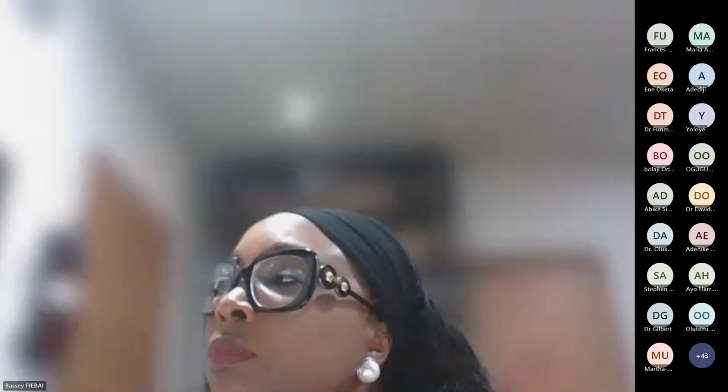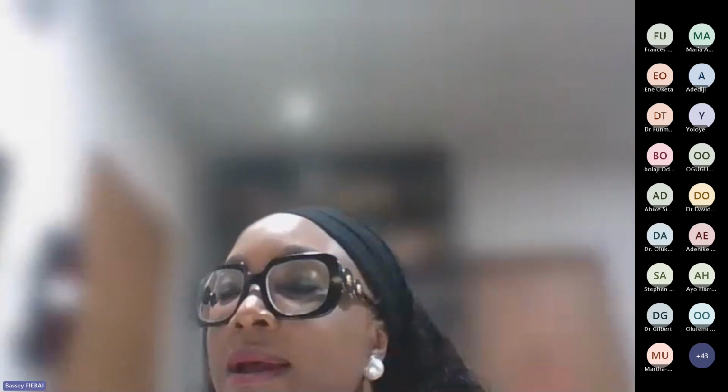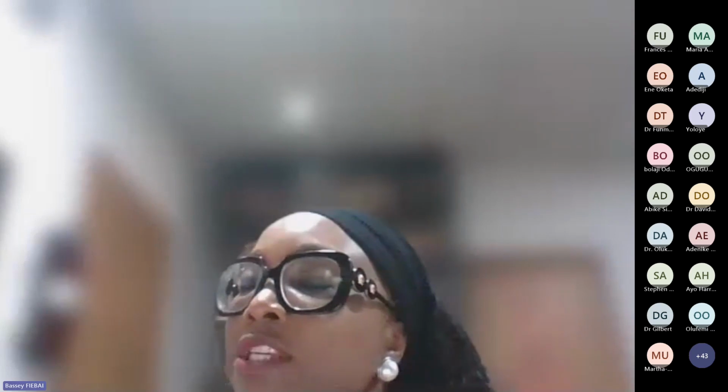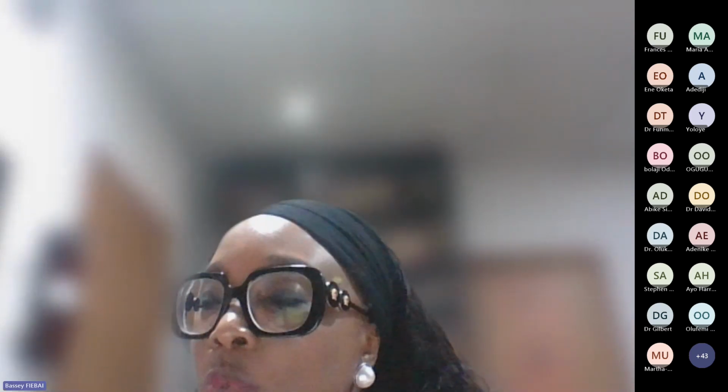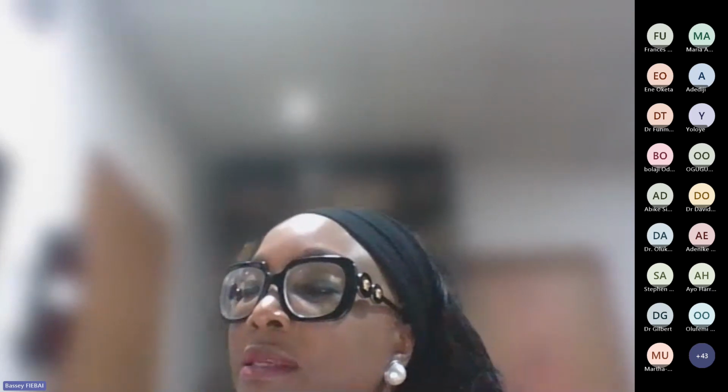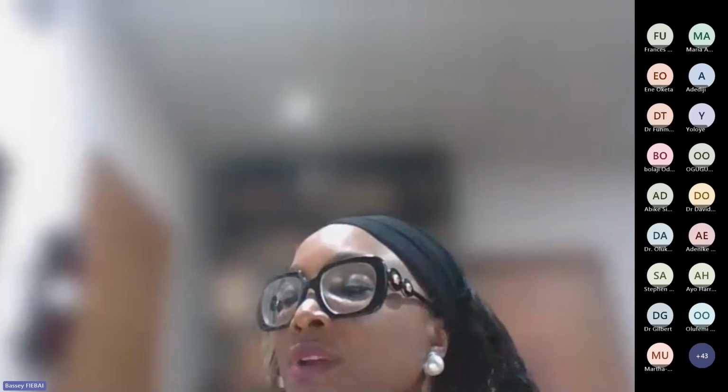So the longitudinal, the orientation of the marker, the orientation of the probe is perpendicular to the globe, and you bypass the cornea. You don't put it on the cornea. It is transscleral. Do you get that? Yes.